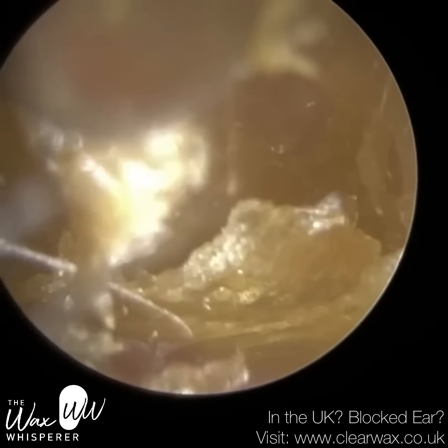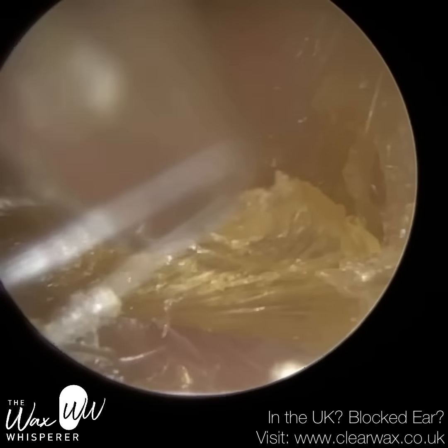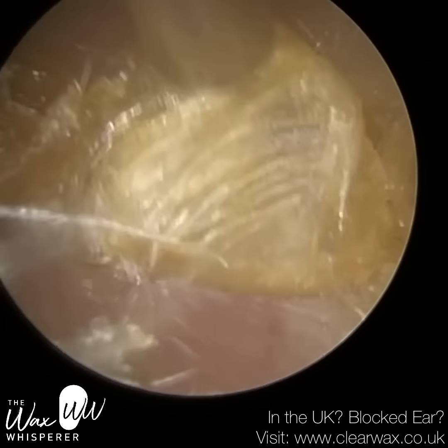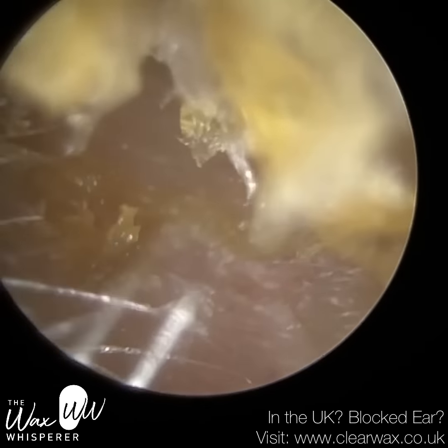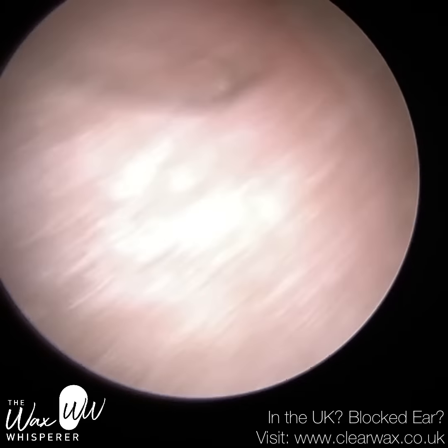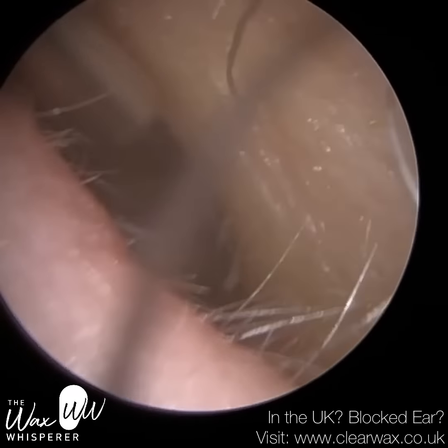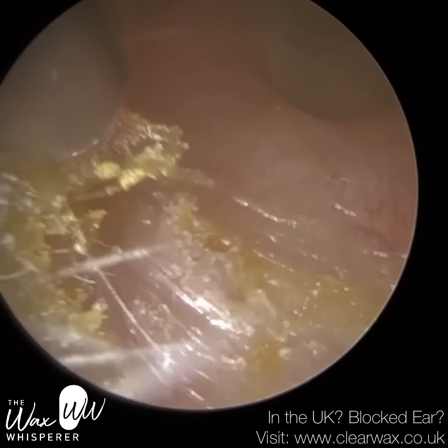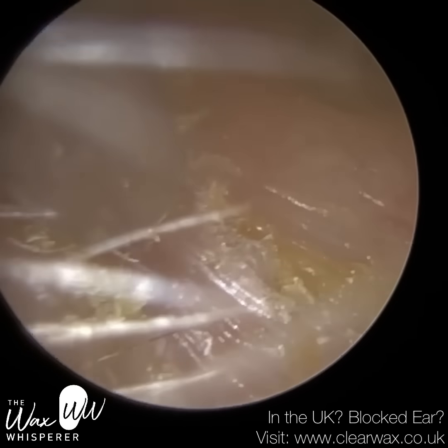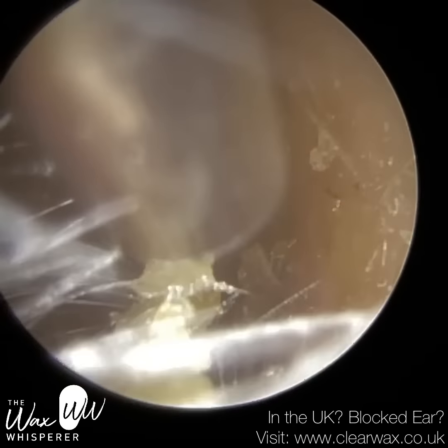So it's just at the base of the ear canal. It's almost like a little pit here. The ear canal goes down and it comes back up, and quite often skin, as it's trying to migrate out of the ear, if you've got a little dip like this patient has near the entrance of the ear canal, that skin gets trapped and it can't get over the dip, and then it collects. And sometimes that skin can then erode the underlying structure, the bone and cartilage that's underneath the skin, and again that can cause some issues.